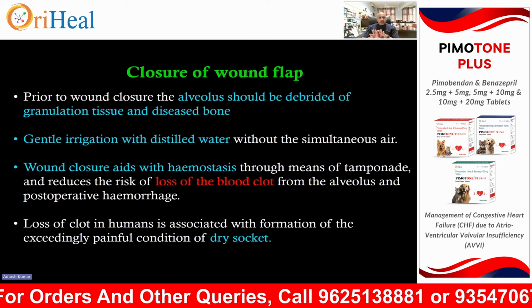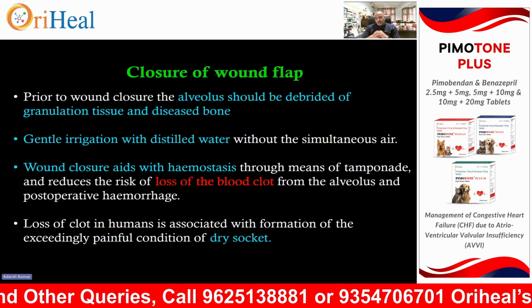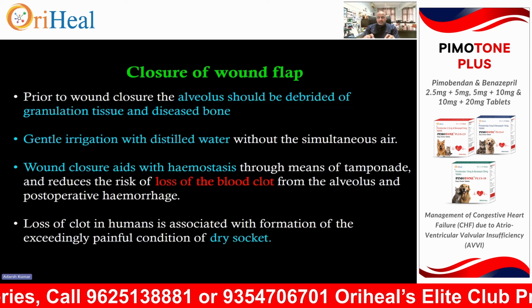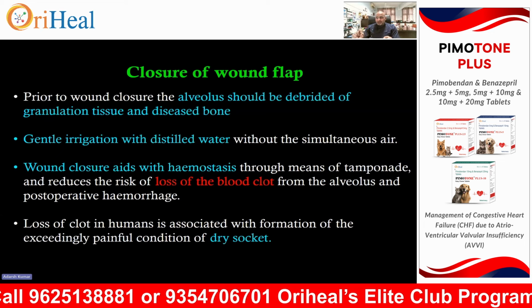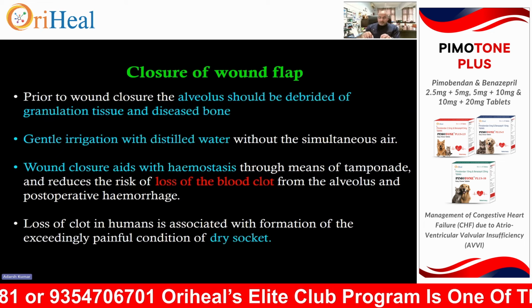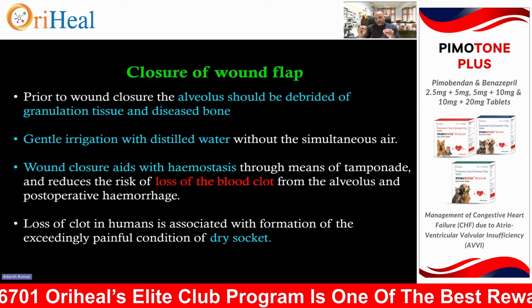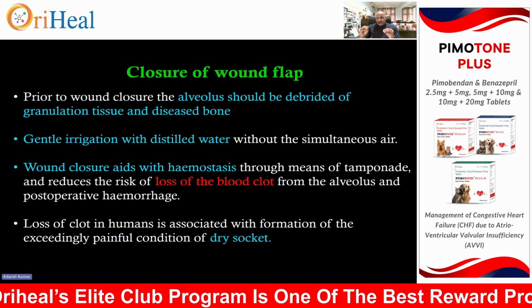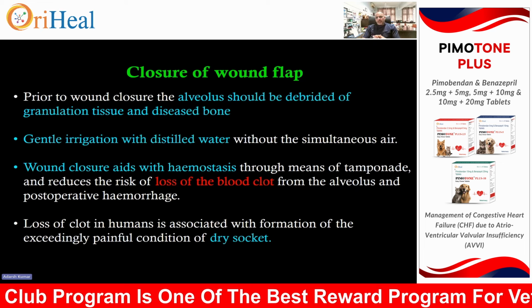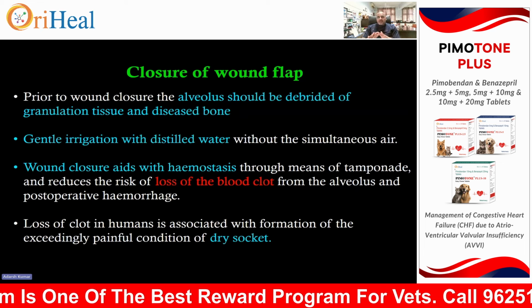Prior to closing the alveolus, you should debride the granulation tissue and the diseased bone, right? Gently irrigate with distilled water without the air. Don't give much air, because you do not want to lose the blood clot from the socket. If you lose the blood clot, we call it a dry socket, and dry sockets are very painful in humans also. Although not much study has been done in dogs, don't leave the socket dry.